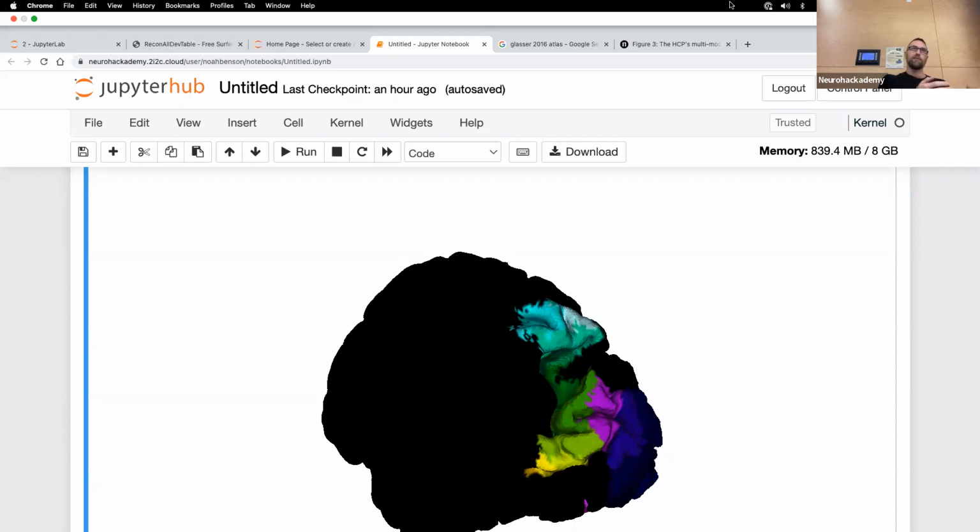When you process your data with fMRIPrep, you can say you want the output to be in MNI space, in which case it'll give you a lot of volume, right? And then you're going to take individual voxels and do this GLM on each voxel, right? Or you can tell fMRIPrep that you want the output to be in what's called FS native.